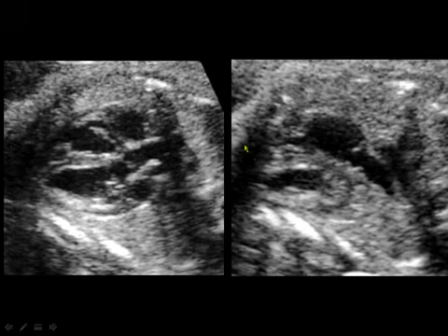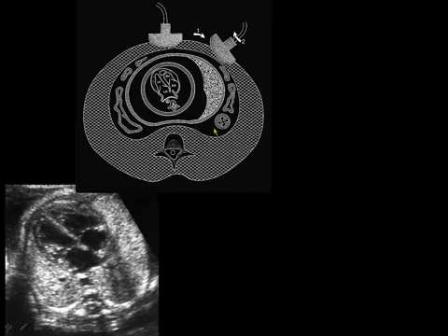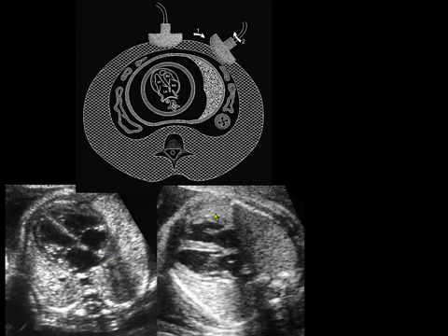We'll move to the ventricular outflow tract. This is the left ventricle, and this is the right ventricular outflow tract, and then how to obtain these. If you go to the straight axial four chambers view, if you are scanning in the anteroposterior plane, you will see this image. Just tilt your probe to the side to scan the heart from the side, and then you will see the heart like that. You will see that your scanning beam is coming from the side. You will see that the four chambers is tilted to the side.